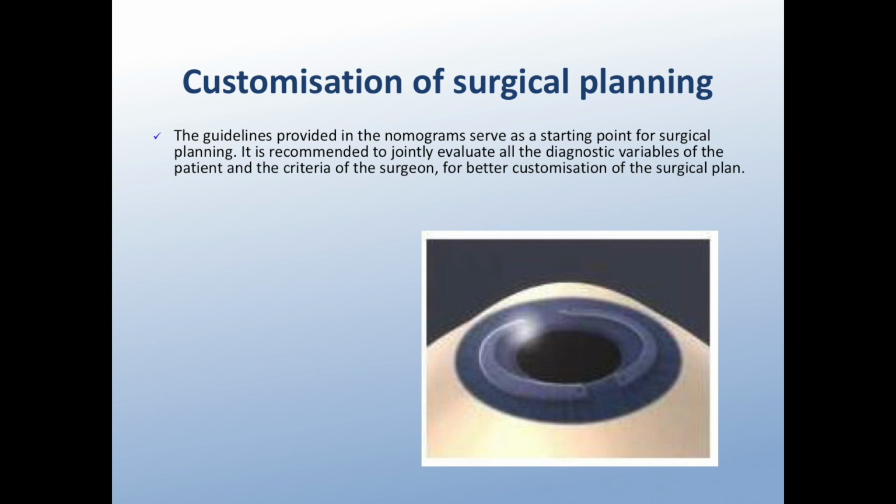Another trick is to mark with the marker in the preoperative phase all these points, then the entry point and the bisector to understand where to place the ring, and never mark intraoperatively. For the majority of femtoseconds, I recommend to also mark the 0180 because the suction ring has two clicks, usually 0180, and then you can align the 0180 with the 0180 of the cup.